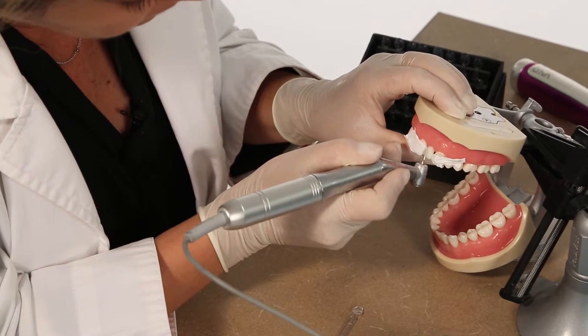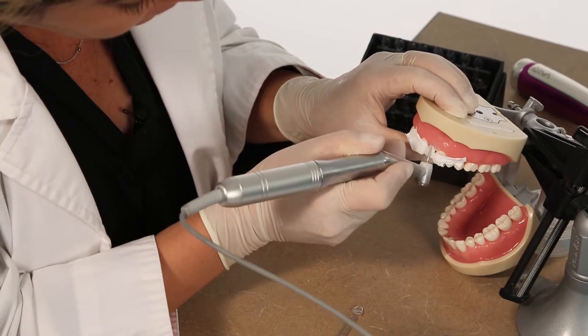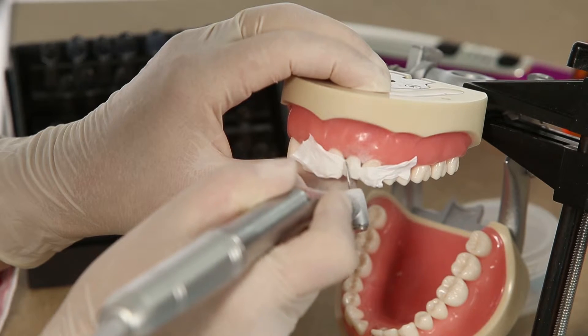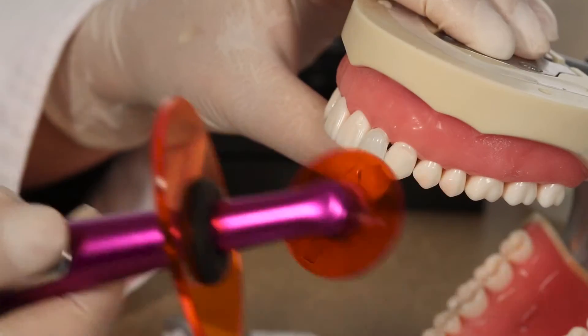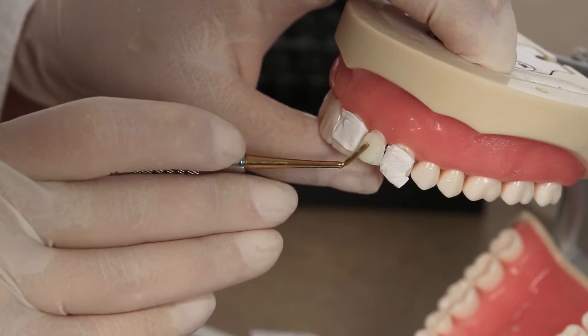Some restorations may require an additional layer of composite. In this case, roughen the cured composite with a diamond burr, bond, cure, and repeat the process.